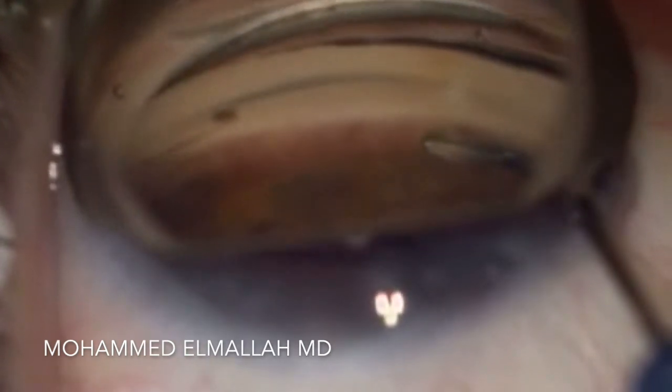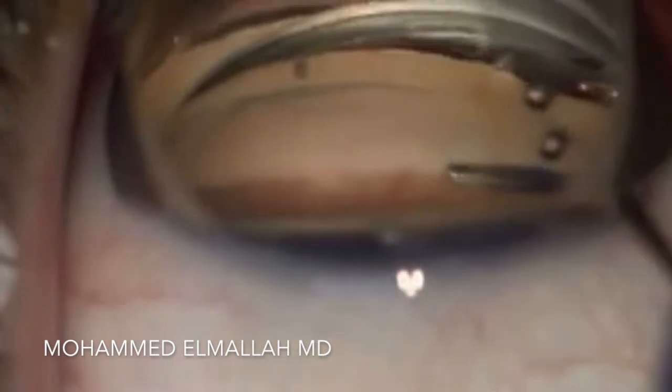The device comes in a cannula, and there is a roller that you advance with your index finger to advance the device into position.